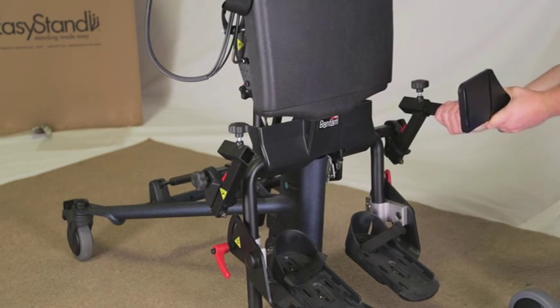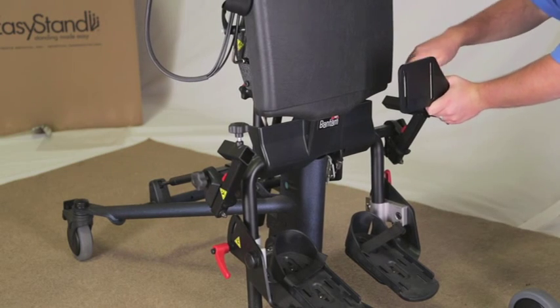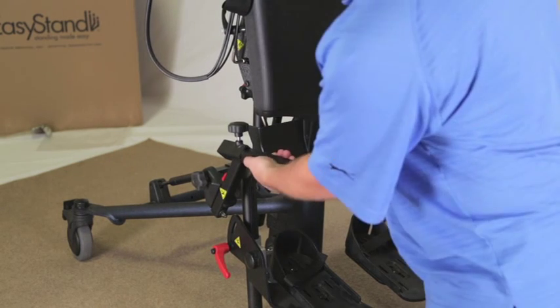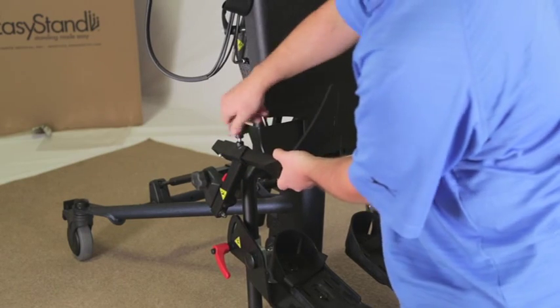For swing-away knees, place the knee bracket assembly into the tube and tighten the knob on the assembly securely. Insert the knee pad bracket into the tubes on the knee bracket assembly. Tighten knobs securely.